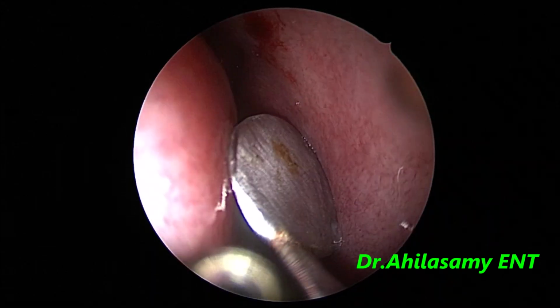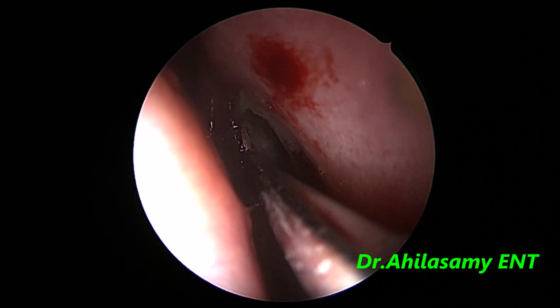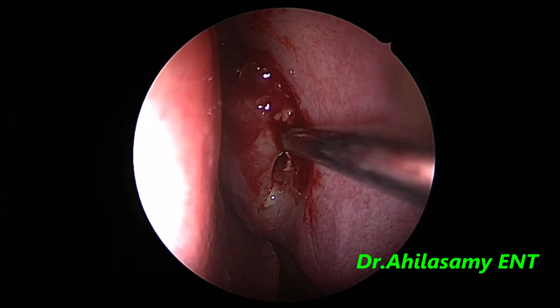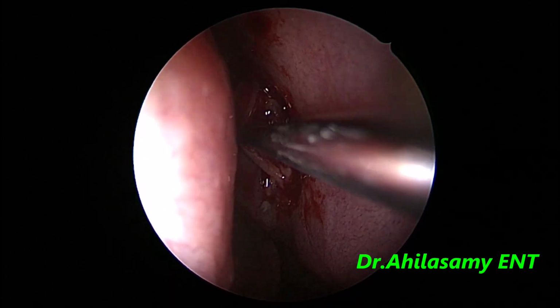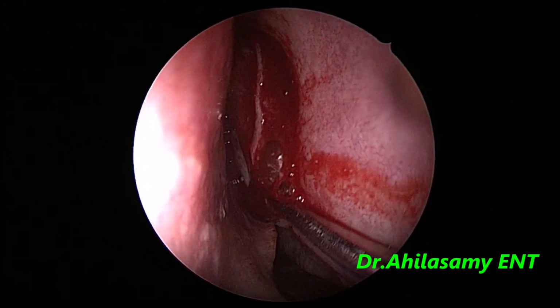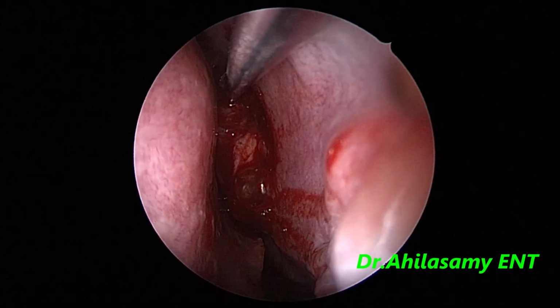Now I am using my own design, Dr. Ahila's uncinate dissector, to dissect the uncinate process. Because it is a very inflamed case, it is bleeding a bit more than the usual local cases, but definitely lesser than the GA cases. Please watch these videos on a big screen, on a TV monitor or a laptop, or pair your mobile to a big TV screen and watch to appreciate the quality.